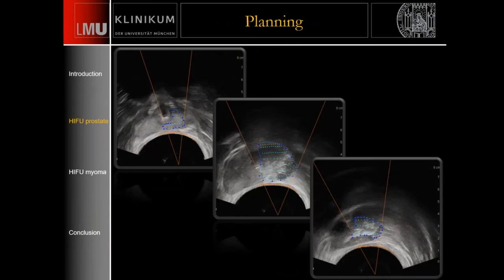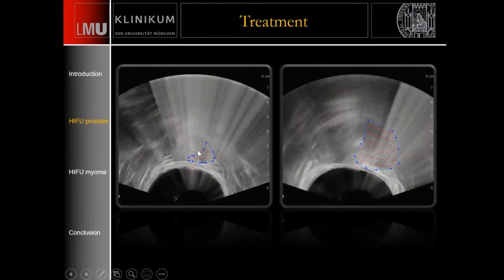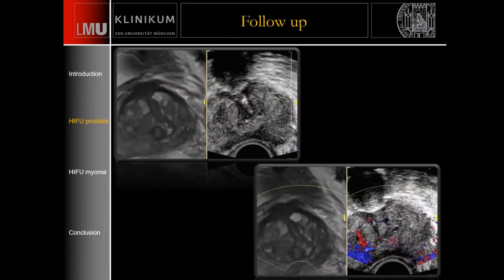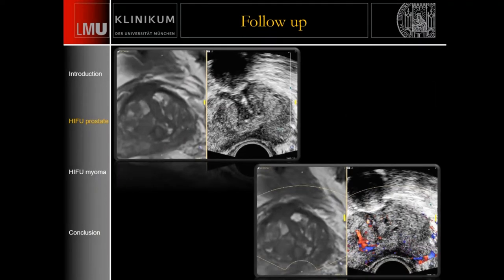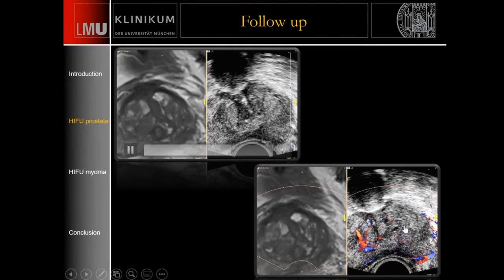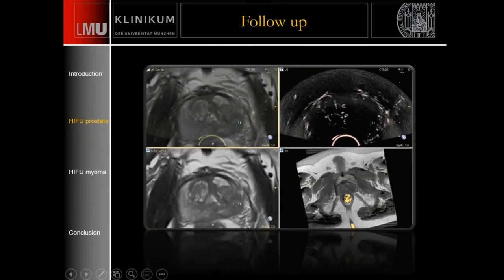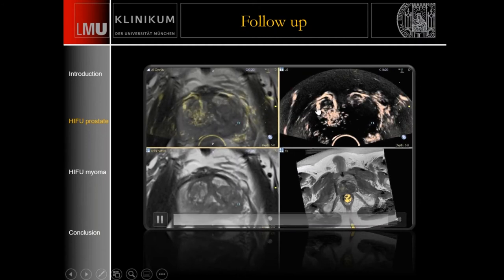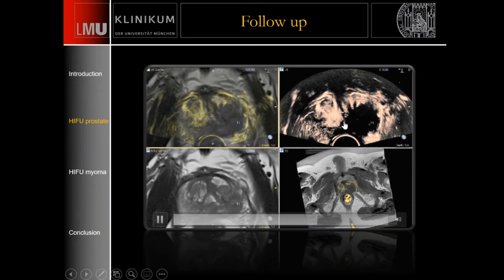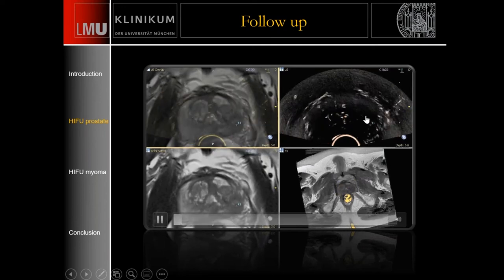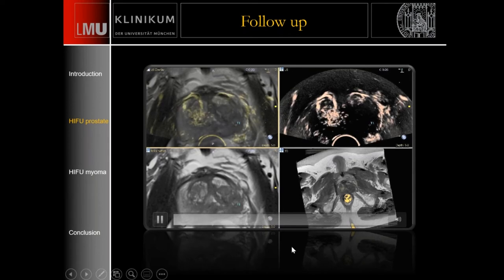This is the planning for where to perform the HIFU directly under ultrasound guidance in the operating theater — a half-prostate focal ablation. During the ablation, you see these lines, which are the artifacts from the ablation. We then follow up directly in the operating theater to determine whether treatment was successful. Comparing the right lobe and left lobe of the prostate, there are no major vessels on the treated side. A repeat contrast examination shows tiny vessels in the surrounding tissue but a large area with no contrast uptake — confirming good necrosis after HIFU therapy of the left lobe.